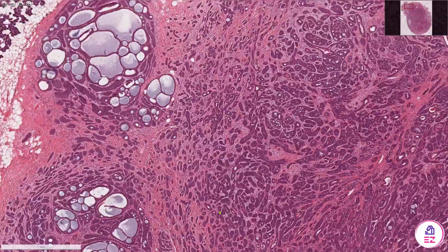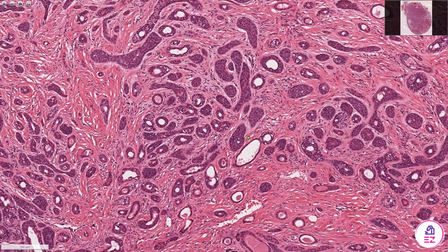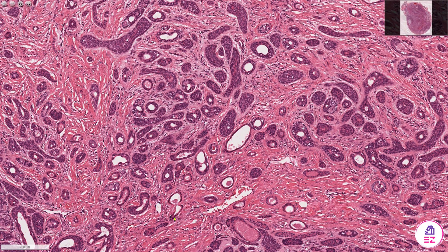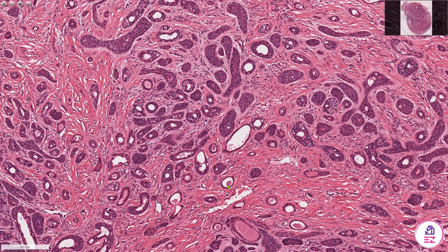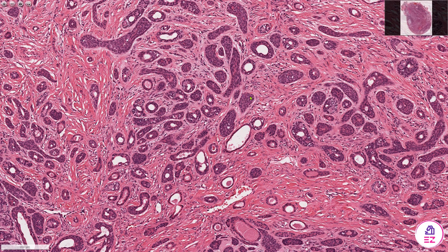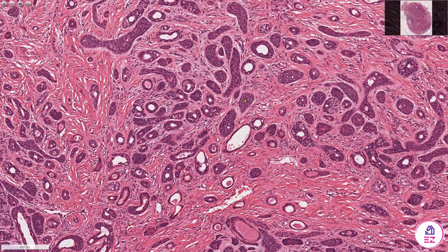If we transition to an area up here, this is what I'd describe as the tubular pattern — quite simple tube-like structures. Some of them are bilayered, whereas some of them have multiple layers of epithelial cells.